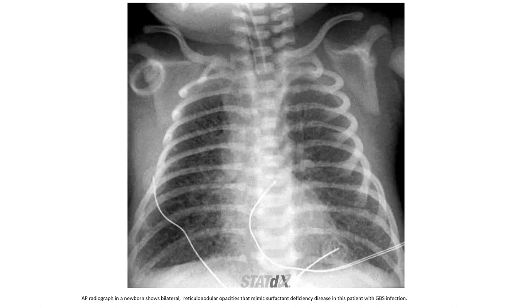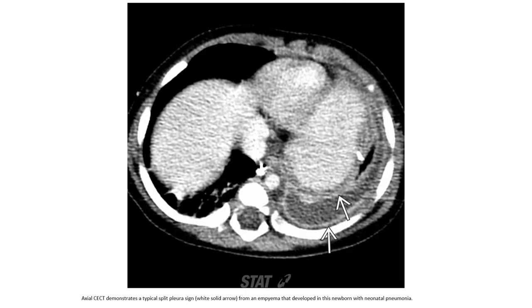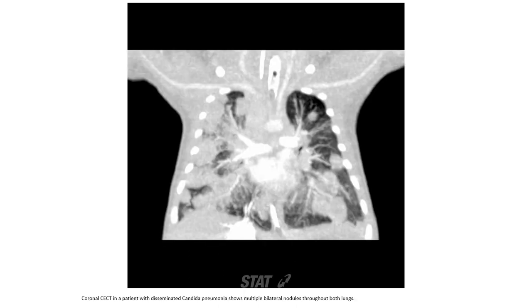Another case — newborn chest. Bilateral reticular nodular opacities mimicking surfactant deficiency disease in a patient with group B strep infection. Contrast CT shows split pleural sign from an empyema that developed in this neonate with neonatal pneumonia. And again, contrast CT in a patient with disseminated candidiasis pneumonia — multiple bilateral nodular opacities throughout both lungs.